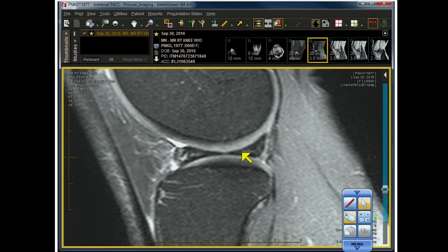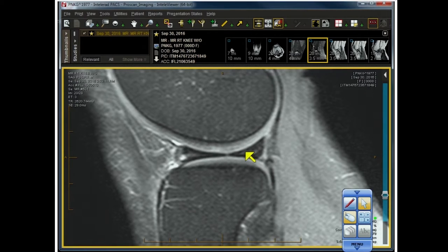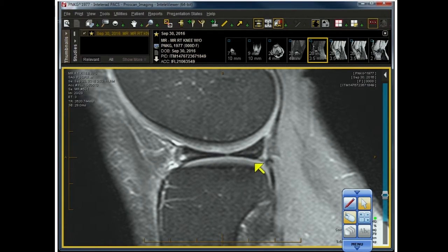Lots of people have signal in the inner third — in fact, everybody does who's over age 60, because everybody over age 60 has a cleavage tear. But we're not going to operate on it, so you have to learn to distinguish. You have to learn when to hold them and when to fold them, because once the meniscus is out you can never put it back in. There is no procedure that works to put it back in. The signal should never run with equal intensity all the way through the body.